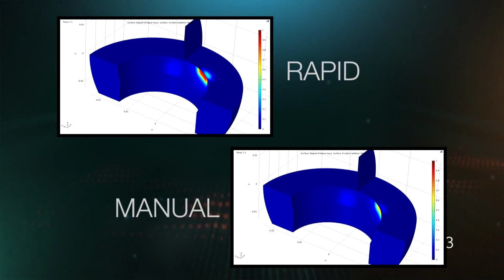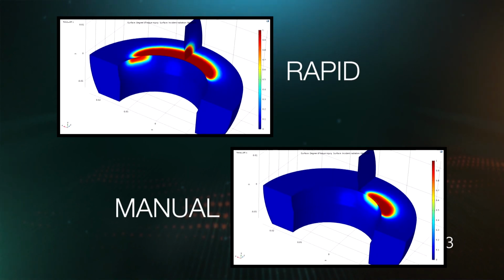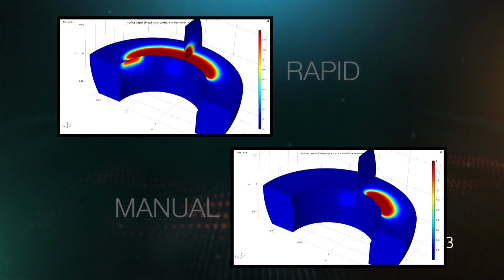Meaning, if you look at the simulations that were done, and these simulations have been done to understand this actually fundamentally new way of delivering the energy versus the discontinuous step by step, you see that with this new energy delivery platform, with this new way of making a lesion, with the energies we're using, we're actually more likely, I believe, to make a single continuous lesion, to make a lesion without a gap.